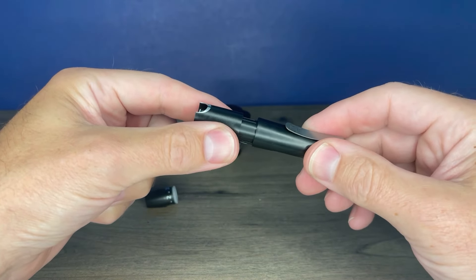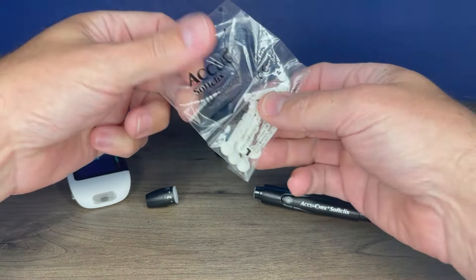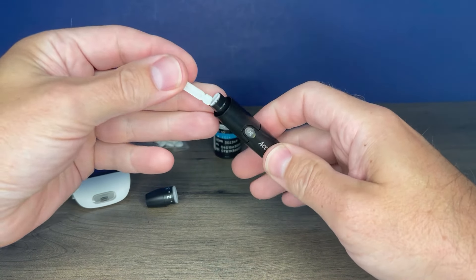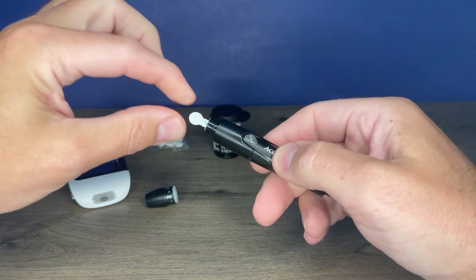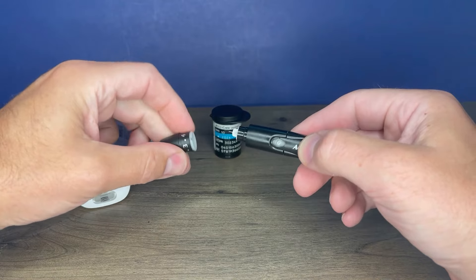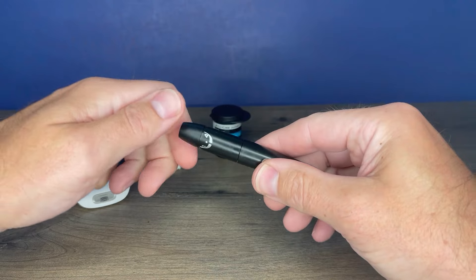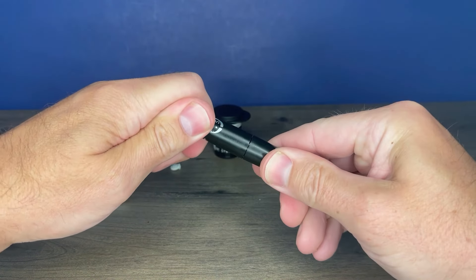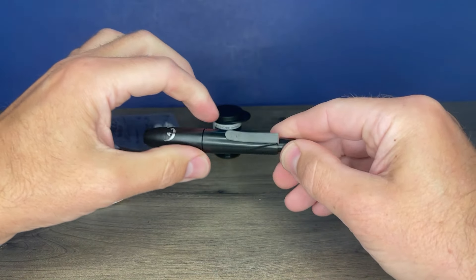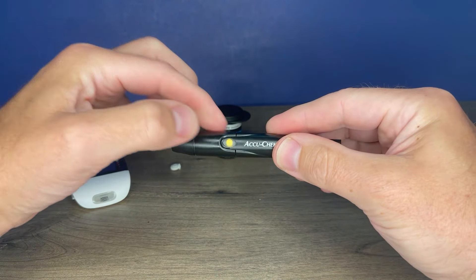The sleeve, when pulled forward, will eject the lancet. Get your new lancet — lancets are single-use items, so you want to use a new one each time. Put it in until it's fully seated. Twist the top off and remove it — that exposes your lancet. Then properly replace the cap until it snaps into place. You can adjust the depth by turning the top of the lancet device; I usually start around three or four and adjust from there as needed.